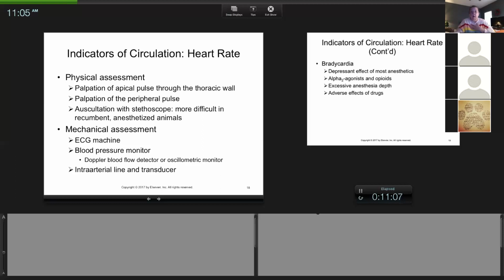But again, what I tell the student is if your ECG looks funky, if your number is freaking you out, put your stethoscope in and listen. Does what you hear match what you see? That's the fastest way to determine, is there a problem? That's common sense. I've had people stare at an ECG and freak out and not even pick up a stethoscope.